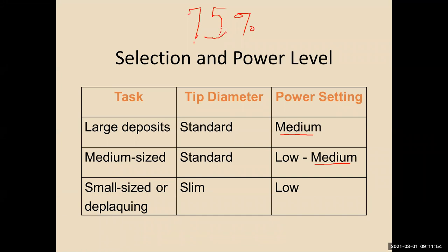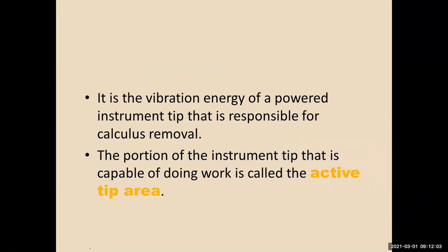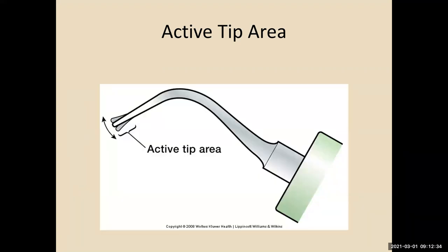A lot of this is using these correctly. So we know that the tip vibrates, and that's responsible for removing the calculus. So the portion of the tip that's capable of doing its work is called the active tip area. Now for our hand instruments, that is our cutting edge, that lower tip third or toe third. On powered instruments, it's the vibration of the active tip area that removes the calculus. Tip third.